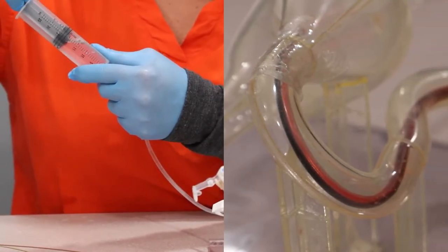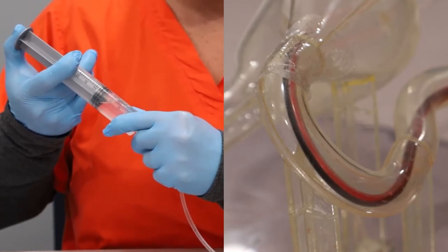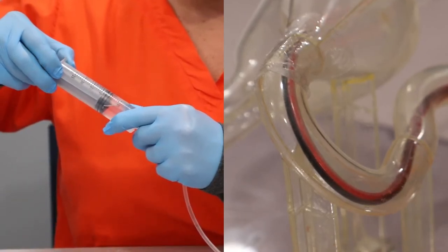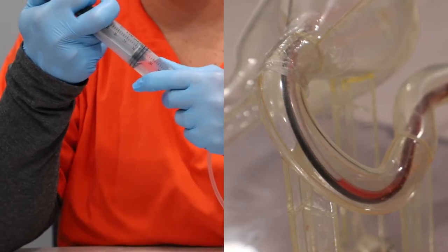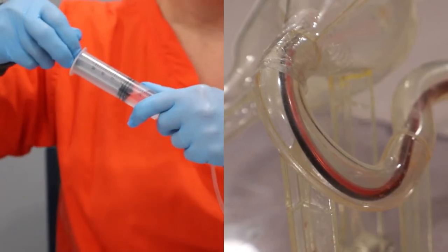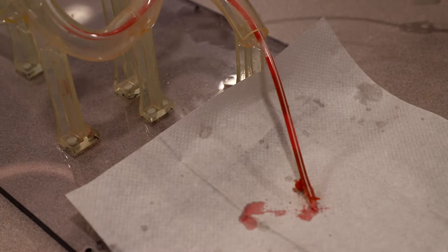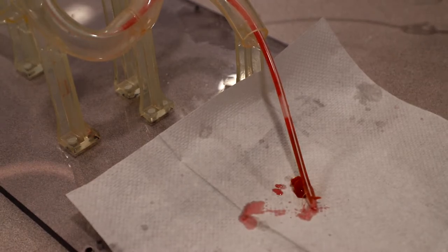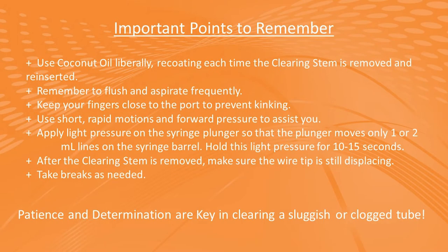Only move it a few cc's either way. After you do a little pumping, hold two to three cc's of pressure for about 10 to 15 seconds. This allows it time to do whatever it's doing inside there, sometimes moving the clog forward. After you have flushed the tube, repeat the whole process two to three more times, reinserting the Clearing Stem until the depth limiter is reached each time.